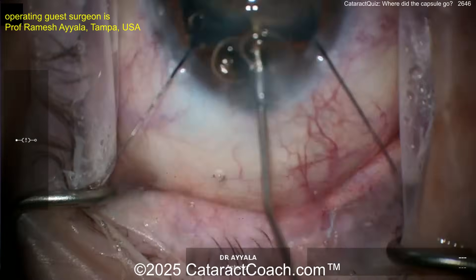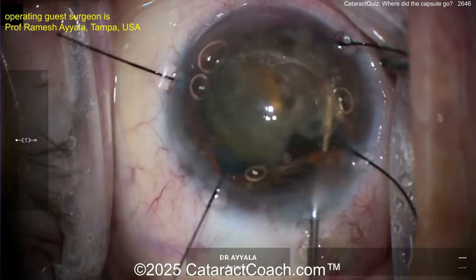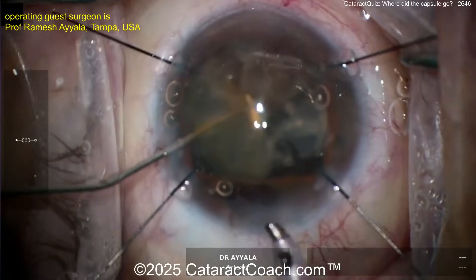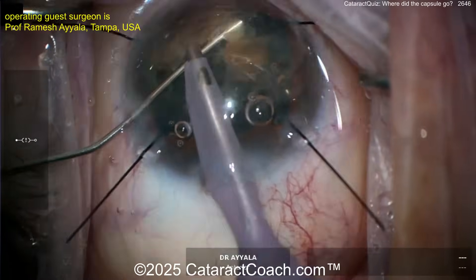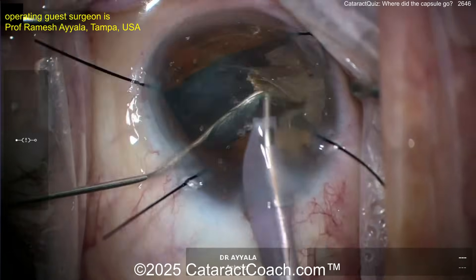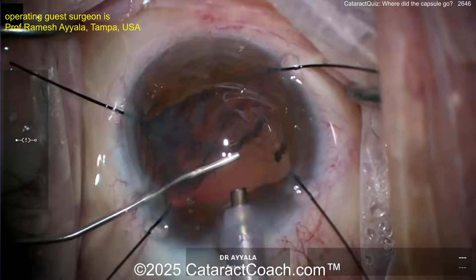A little more viscoelastic to stabilize things. That looks good — get that eye centered up again. The freed-up nucleus — viscoelastic is your friend. Get those pieces brought into a nice position for aspiration. Here comes the phaco probe again to aspirate all this down. In these cases, sometimes it's helpful to put a fifth iris hook underneath the main phaco incision to get that iris out of the way.